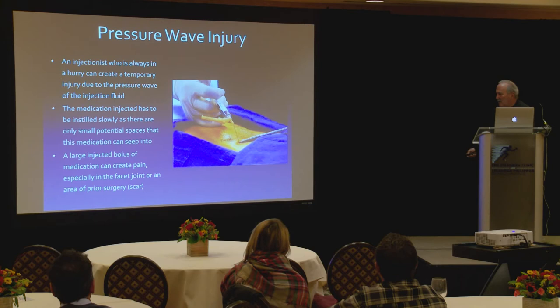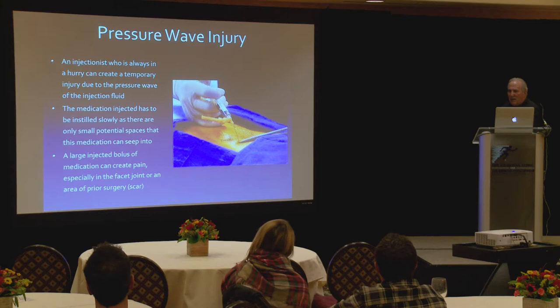You can have a pressure wave injury. I've never seen one with Dr. Evans, but I commonly see this. If somebody's in a hurry, they put the needle in and they're just trying to drive that fluid into a small potential space, you'll get a pressure wave injury and people will be miserable for a day. So it's the technique of how to put this needle in and look for problems that is important.